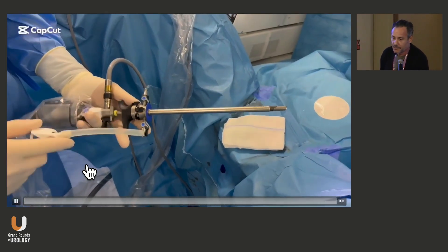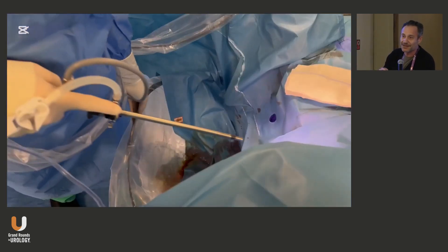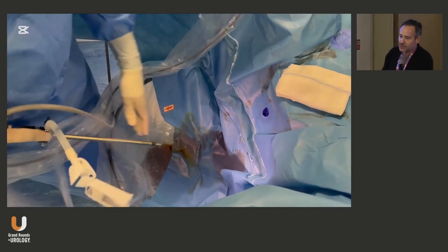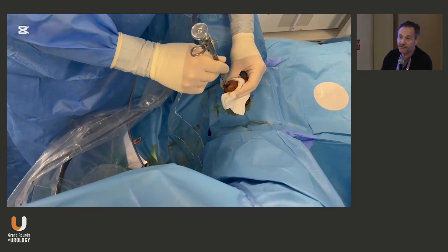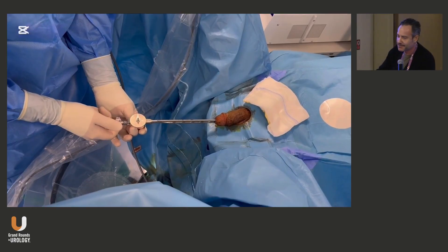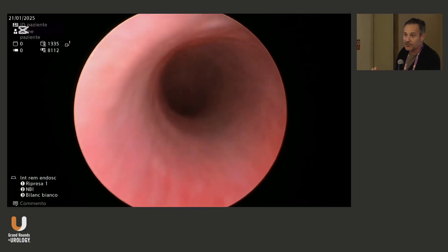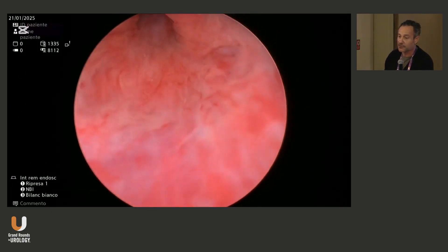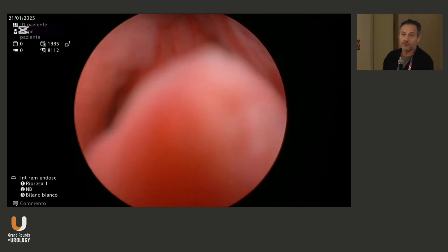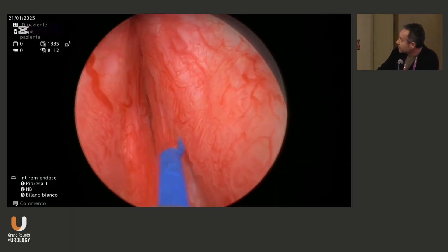I always tell residents to be sure where they place the inflow — this is crucial. Sometimes they don't have vision and put the inflow where the outflow is supposed to be. I use a flexible arc system that helps me stay dry. I like to use the Otis regardless of the size of the meatus, as it helps me prevent meatal strictures. Then we go gently inside the urethra — never force. If you have a urethral stricture, just cut the stricture; never force, otherwise you'll get secondary urethral strictures.